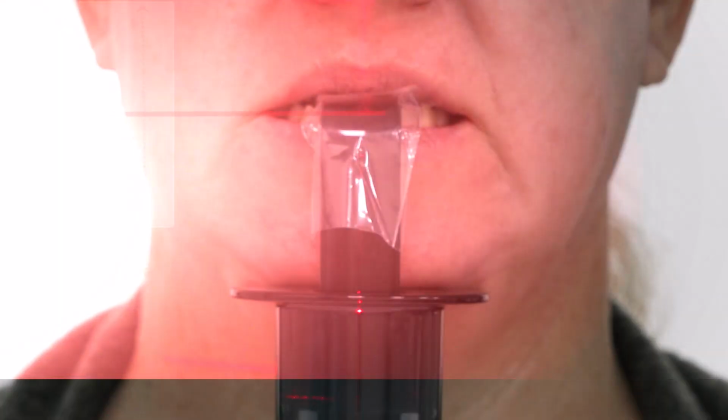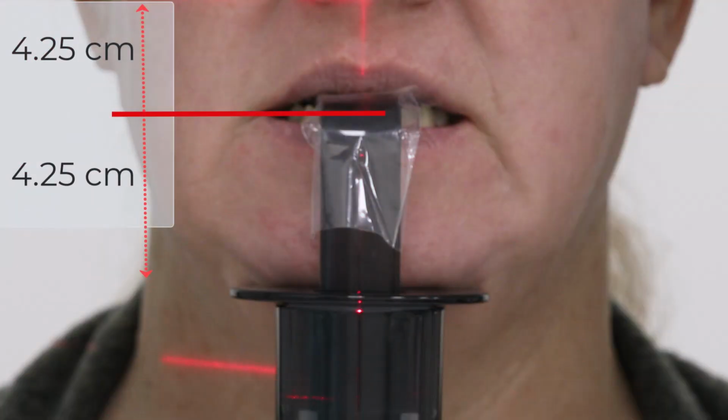When capturing the 12 by 8.5 field of view with a height of 8.5 centimeters, the horizontal red beam will be positioned to display at the center of the 8.5 centimeter in height. This positioning aims to project the beam approximately at the patient's occlusion.